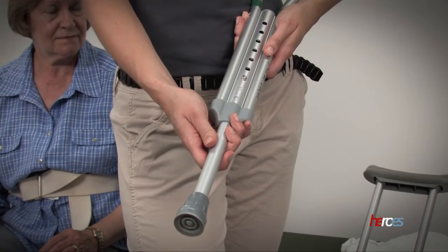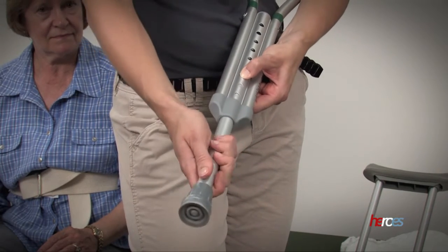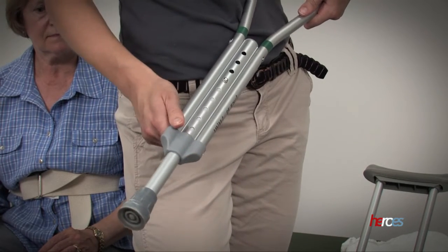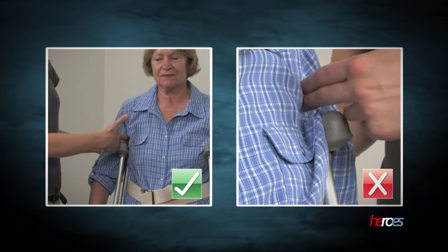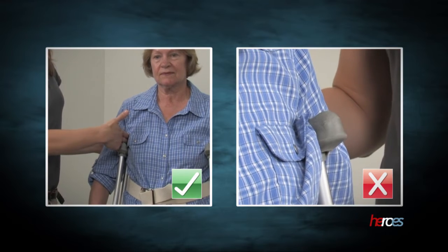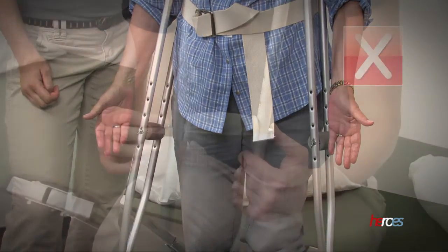First, adjust the height of the crutches using the pin on the leg of each crutch. It is helpful to ask the individual for their height. Before standing up, fasten a gait belt around the individual for safety. The top should rest comfortably under the individual's arm, and you should be able to slide two finger widths between the underarm and the top of the crutch. The level of the handles should fall at the level of the individual's wrist crease.